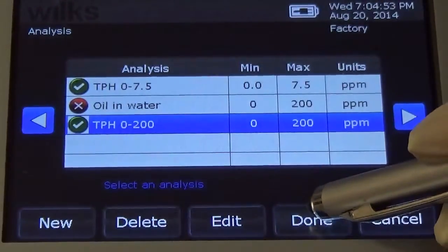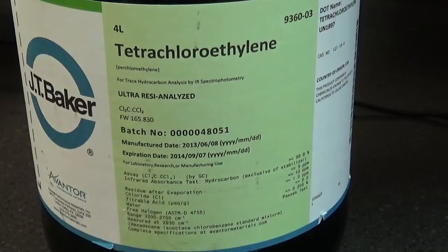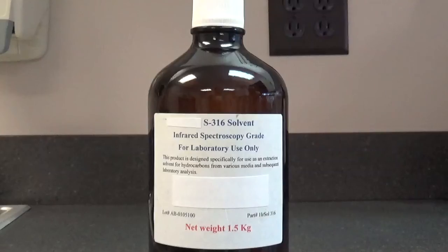Select Done again. For Tetrachloroethylene, we recommend JT Baker Solvent as this is the only solvent available specific for infrared analysis. We cannot guarantee results with any other solvents. Most analysis issues are due to using the wrong solvent or solvent that has been contaminated. An alternate choice to perchloroethylene is S316 solvent.